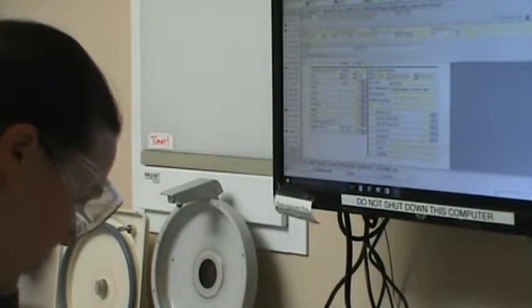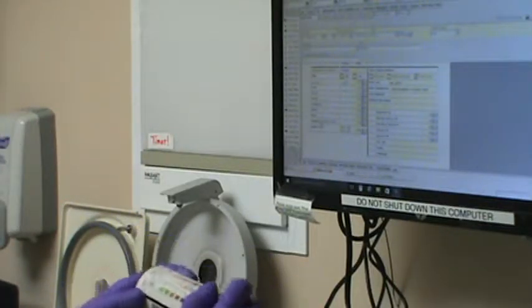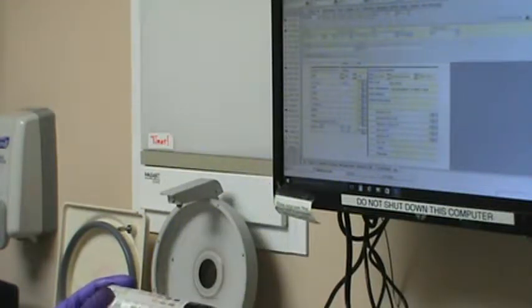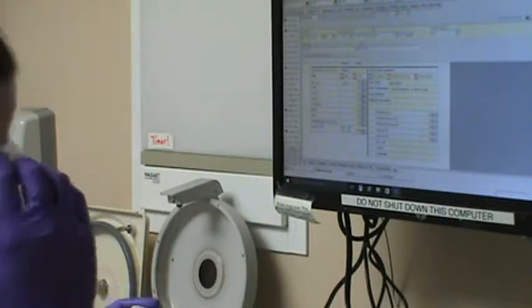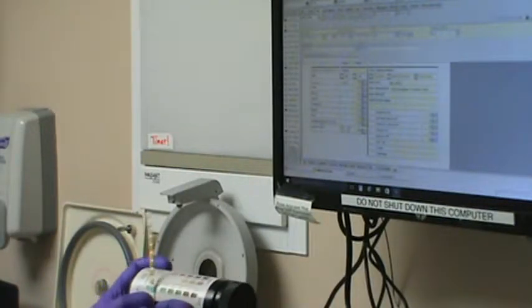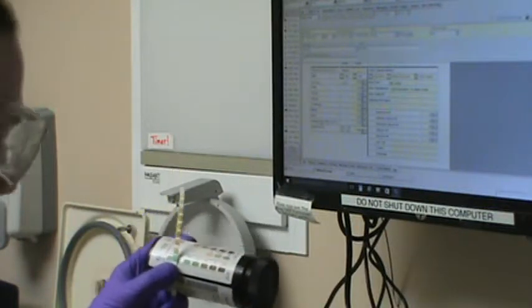Okay, so it's been about 30 seconds, so I'm going to use this as my guide, and I'm going to start reading from the bottom up, because anywhere from 30 seconds on you can start reading from the bottom up. So we're going to line up our bottom over here. The first thing we have is our glucose.